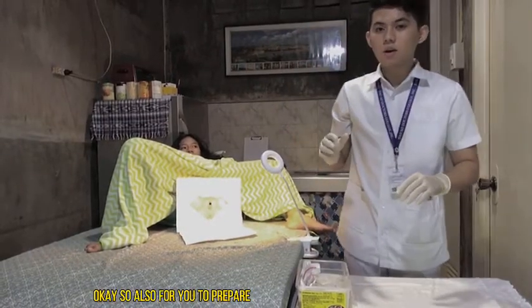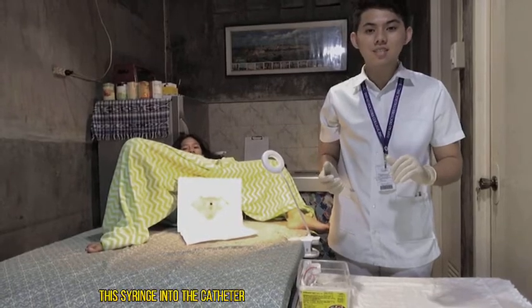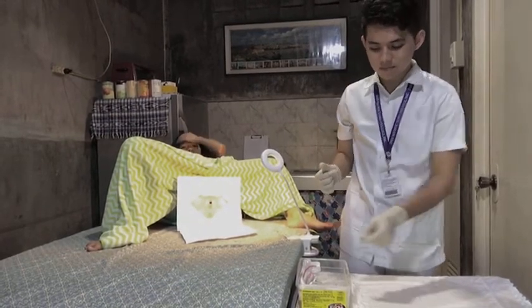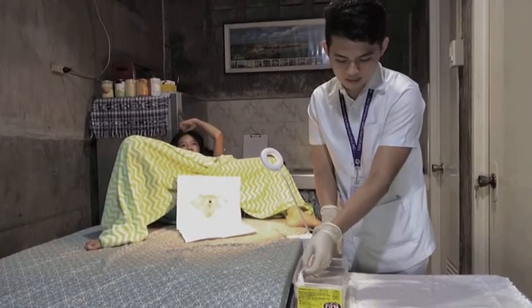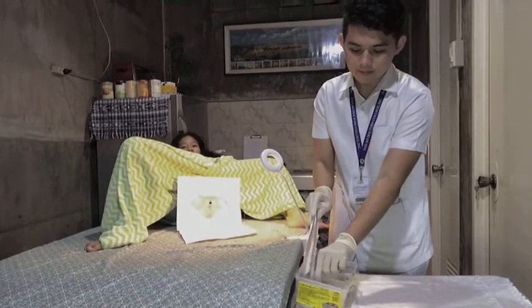Okay. So also for you to prepare, you need to insert the syringe into the catheter to ease the catheterization and the next procedures. So we will be opening now the catheter. This is the Foley catheter that I have been mentioning a while ago.